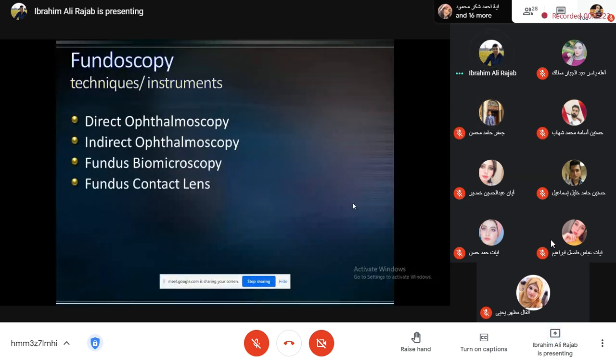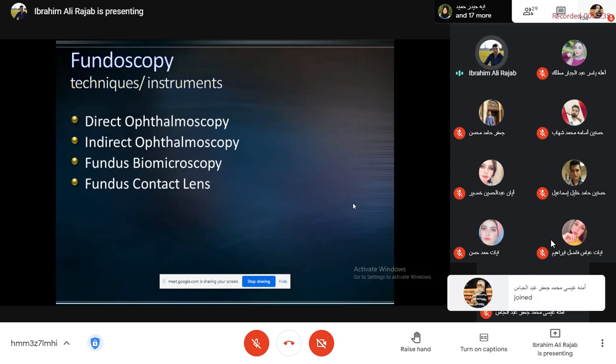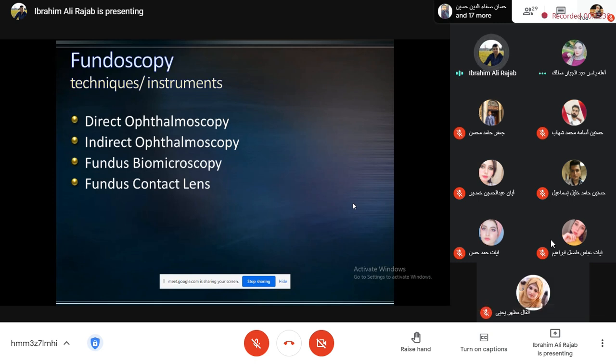Okay dear, thank you. So fundoscopy is the procedure to examine the fundus, which, as I said, is the bottom of the eyeball. So what is the bottom of the eyeball? It is the retina, the optic nerve, and the blood vessels.